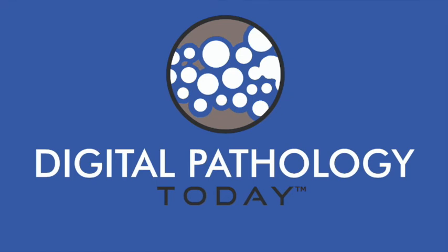Yeah. So now with these digital fellows specifically, do you think of them in terms of quality control? That is, are they checking your work? Are they checking the work of a human being? Or do you see it more as a primary read, and then you, the human being, are checking the work of the digital fellow? So I think there are two models. There's primary read and secondary read fellows. I like the primary read because if the performance is high enough, it's real time and you're not reworking. The secondary, where you make a diagnosis and then the system says, okay, did you get it right? It's a rework process, and that's not going to make me more efficient. So I think the primary read is going to give us more bang for the buck.